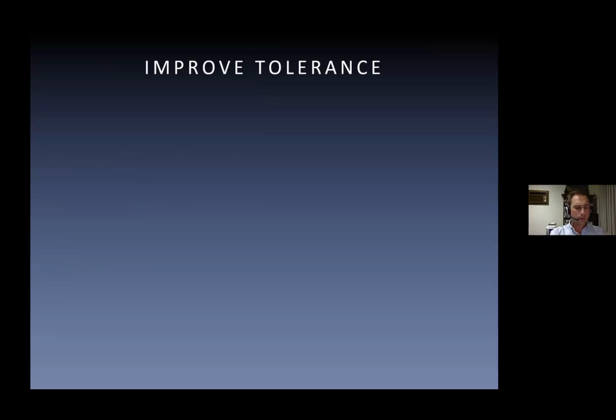So, some techniques for improving tolerance for patients. On the first session, don't start on the side of maximum pain. Let the person get a little bit used to it. So mark and palpate the site where you want to put most of your energy.